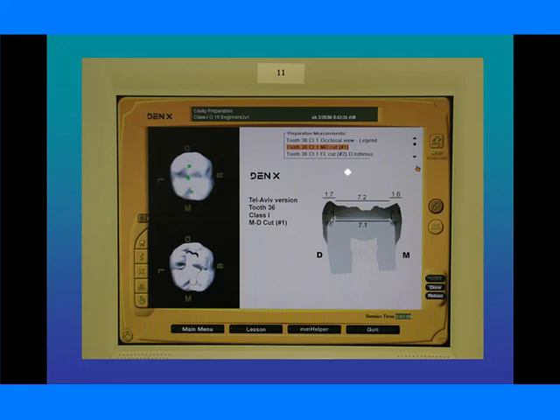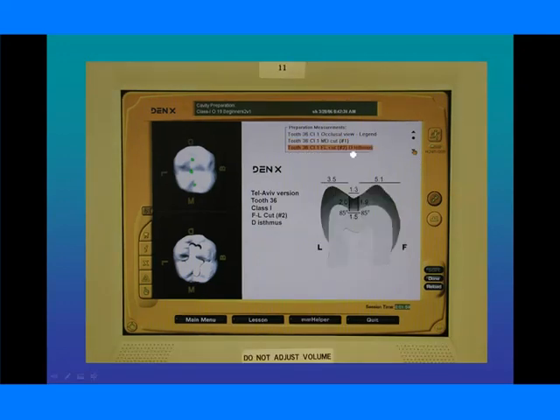Let's go ahead and look at our next cut. Our number 2 cut is through the distal isthmus. There's that term I was telling you about. Our distal isthmus, as you remember from that picture before, is in this area here. You'll notice the width of the floor is 1.5 millimeters. The width of the occlusal is 1.3. The depth is basically 2 millimeters. And our wall angulation is 85 degrees, which tells us that these walls actually, what we call, converge. They converge towards one another. This is another retentive feature of our amalgam preparation.